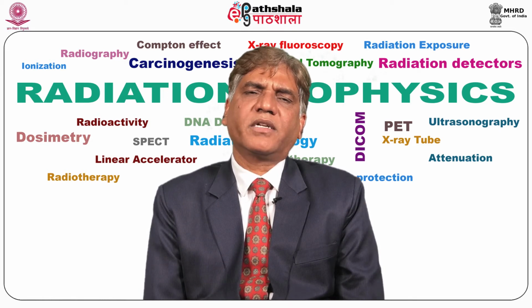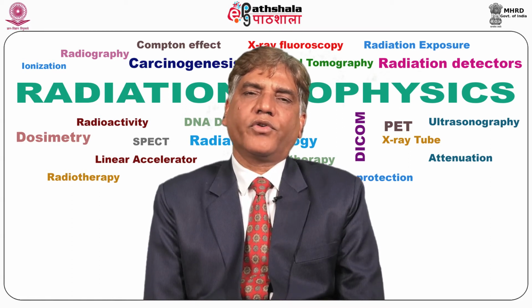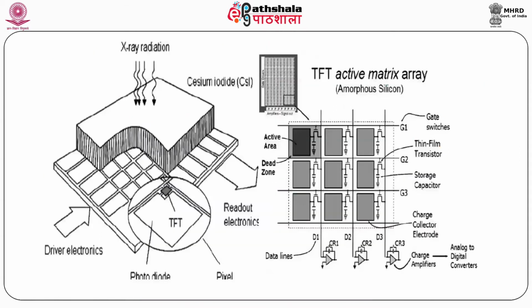Therefore, photodetectors like PMT or CCD arrays are used. A fiberoptic light guide plate is placed before the photodetector, which transmits blue light and attenuates the red light emitted by the laser beam. Photodetectors convert light into an electrical signal whose output is in analog form, as you can see here in this figure.